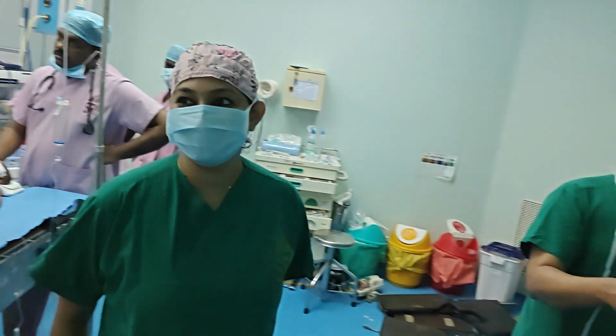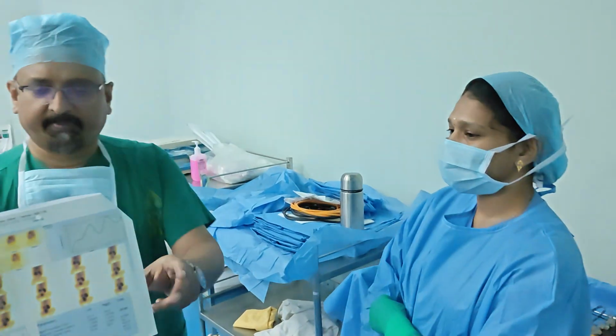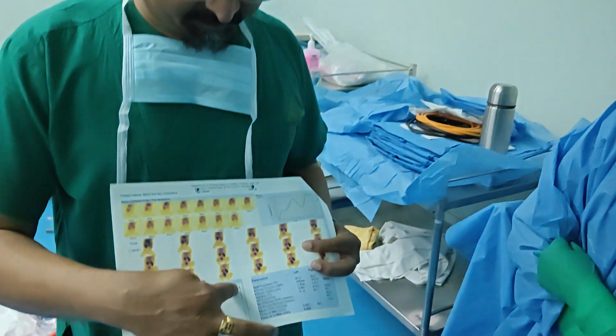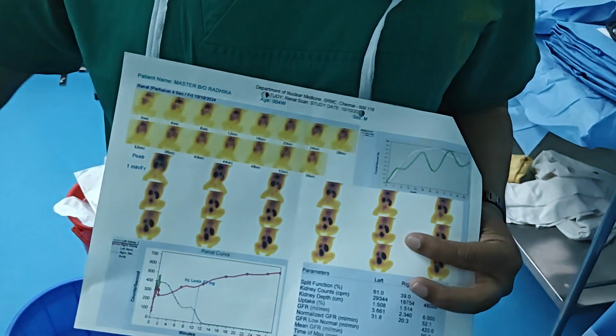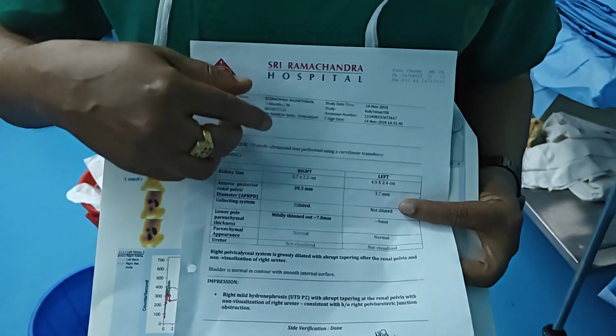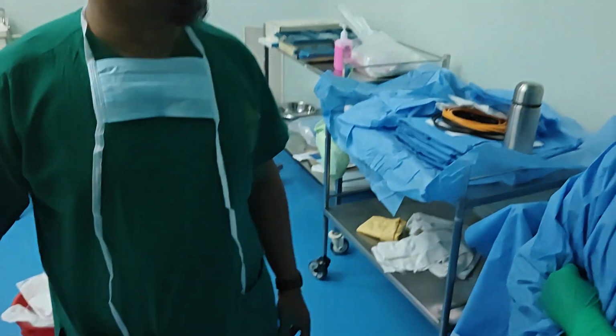So you don't go there, you be here. This is the DTPA scan of this patient, where you can see an obstructed curve, and the function is reduced. The AP diameter of the pelvis is already 39 millimeters. So that is the reason we are doing this.